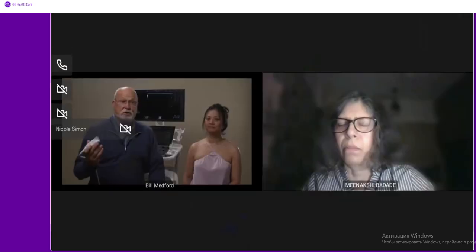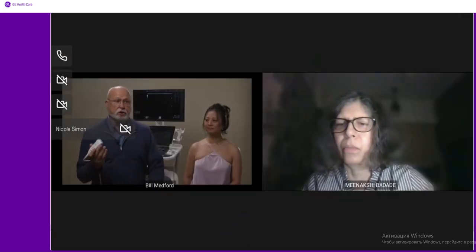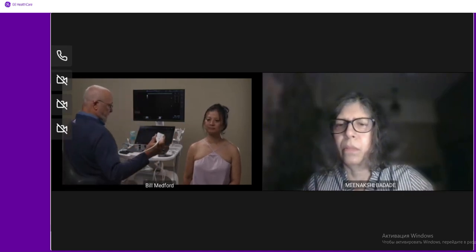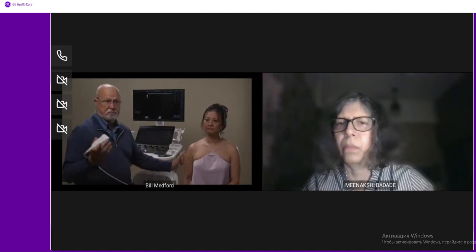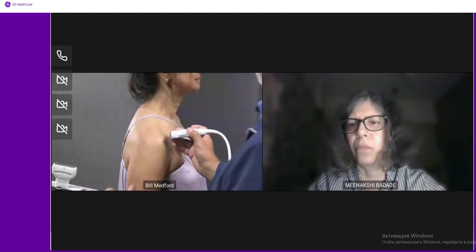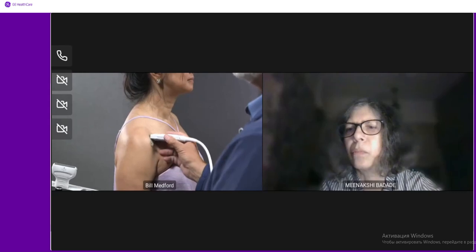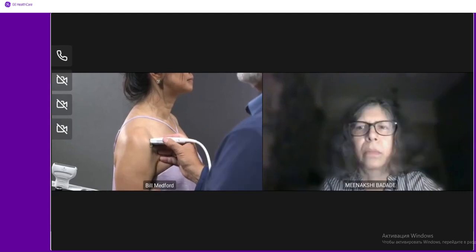The question was asked about the coracohumeral ligament, and let me try to demonstrate that again to assist you. I'm having the patient with their arm down by their side, in neutral position, and placing the transducer in front of the shoulder, identifying the bicep tendon.